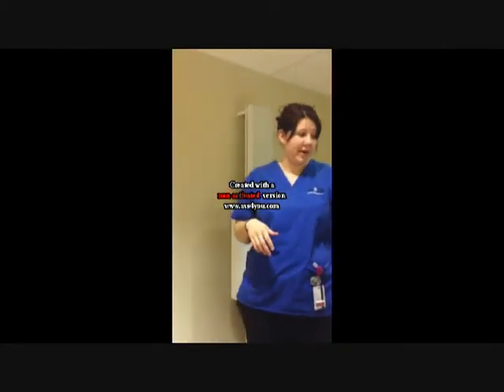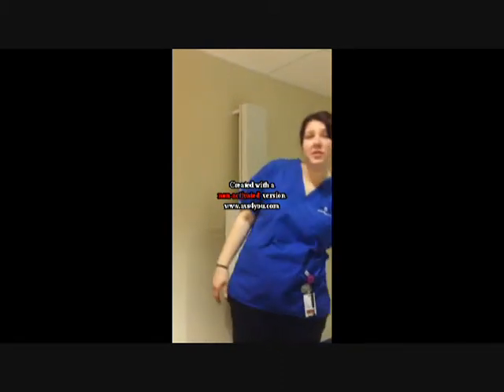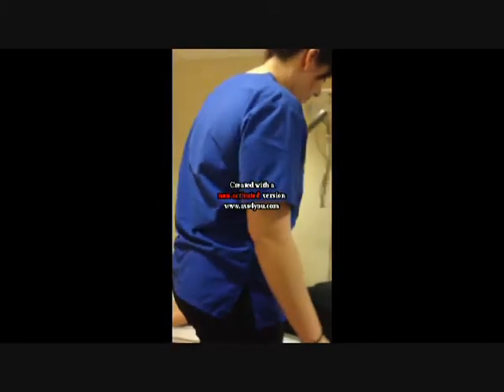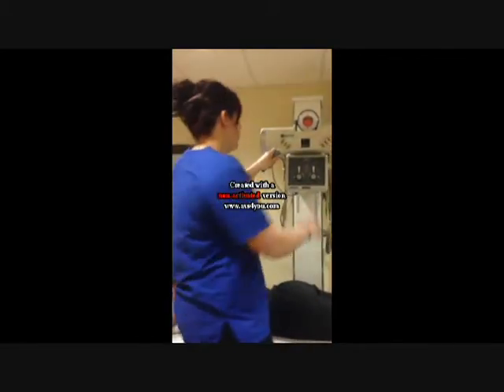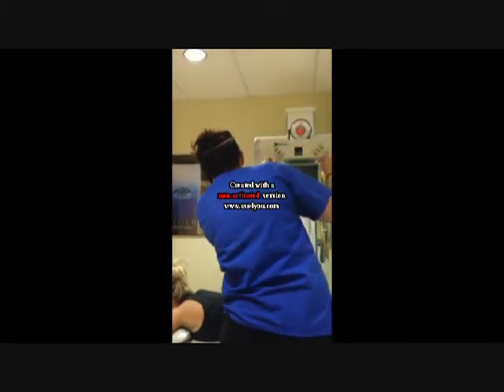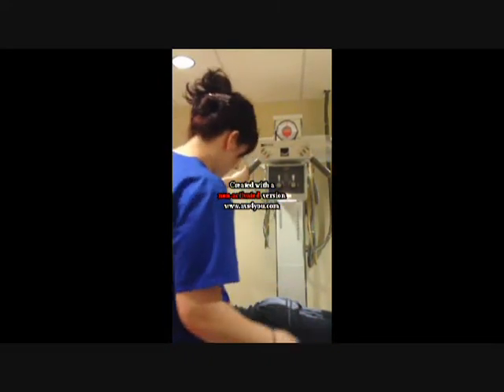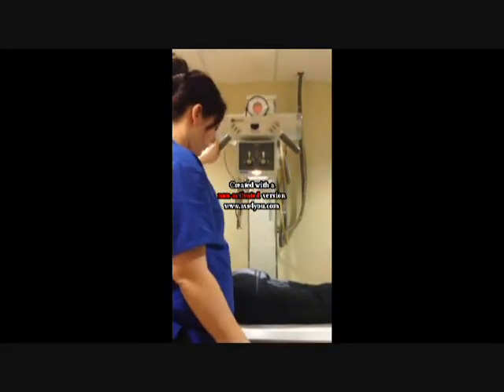Alright, now that we're done with the AP abdomen for upright, we're going to have the prone position. I'm going to have her lay down on her stomach on my table. And I'm going to raise the table up to get it into its detent, because then I can use the chart on the back of the tube to get up to 40 inches for the bucky, not the tabletop. Just making sure that that was in the correct detent.